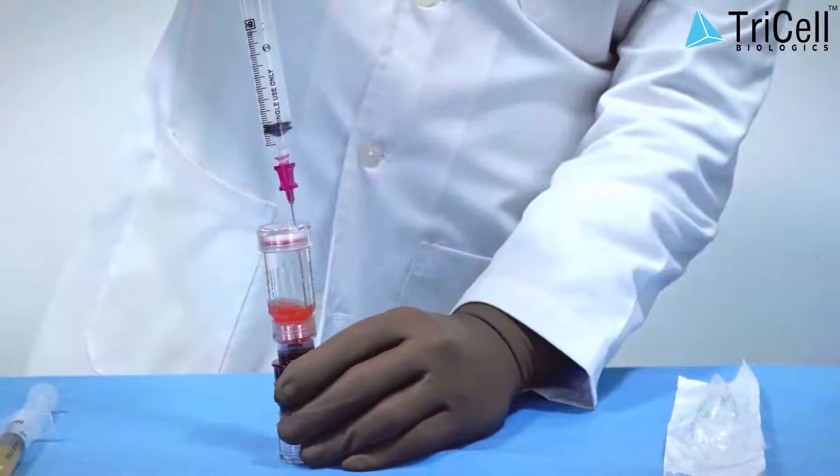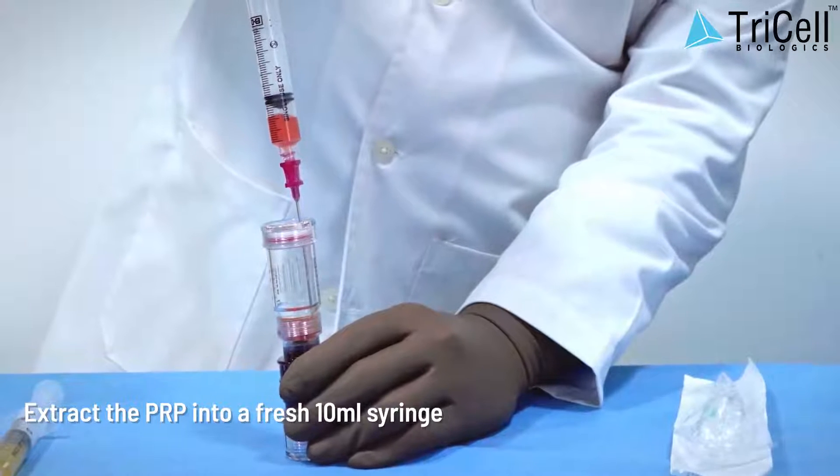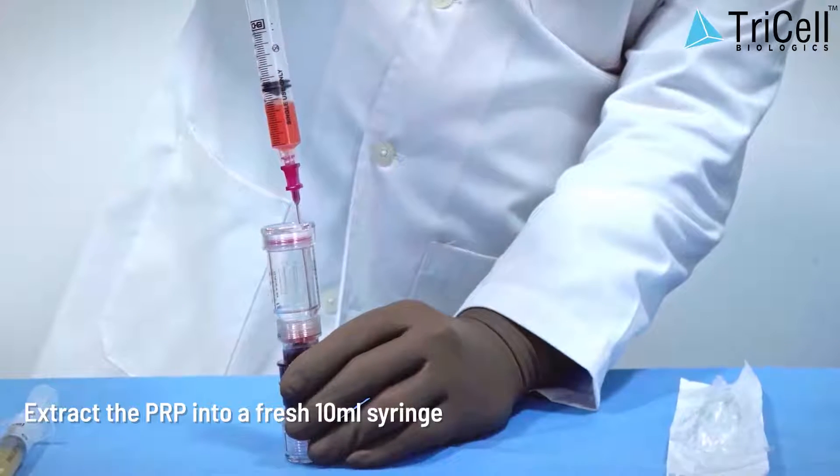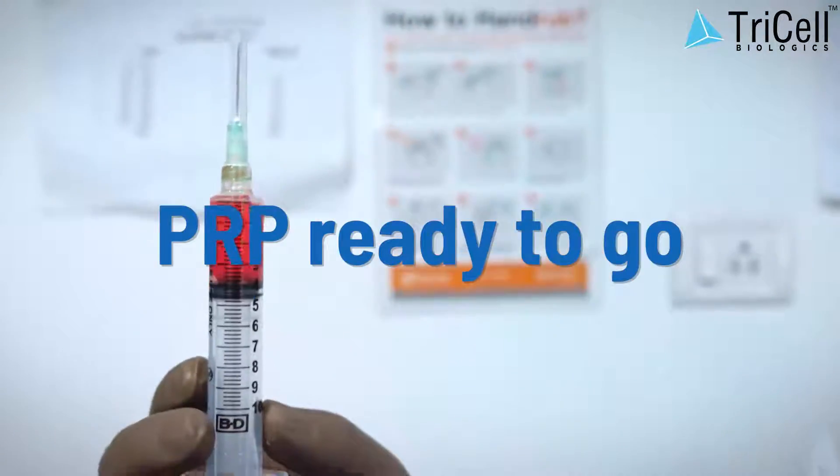Step 11: Extract the PRP into a fresh 10 ml syringe. PRP is ready to go.